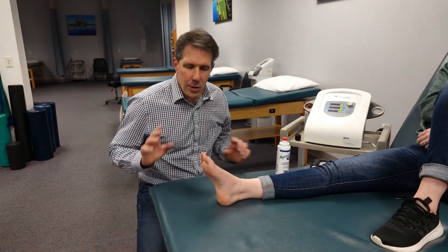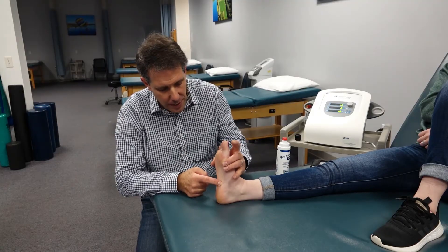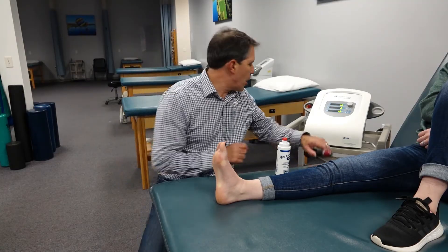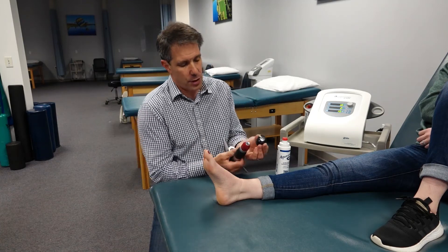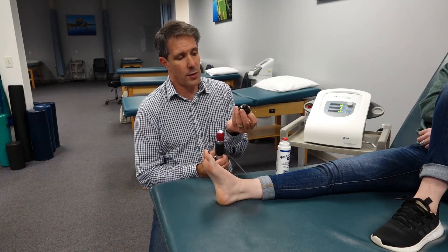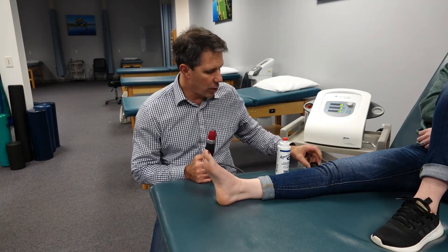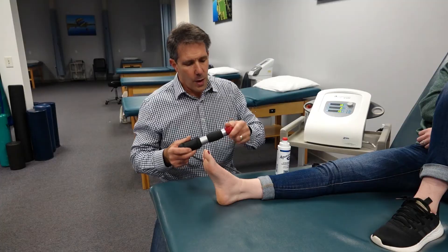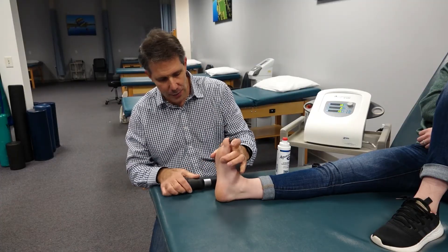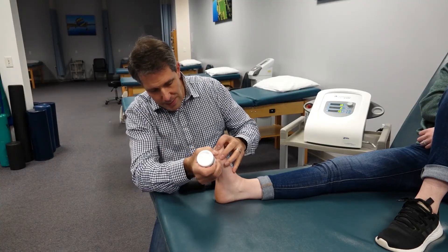Welcome back everyone — today we're going to do a little demonstration on using the RPW on a chronic plantar fasciopathy. One thing I want to mention: there are two different sized heads. The bigger one works better if you're going to be doing a glute, upper trap, or piriformis area. We're going to use the smaller one because we have a small foot here. They're very easy to change out — you just screw it on and screw it off — and you simply use an ultrasound gel as the medium.